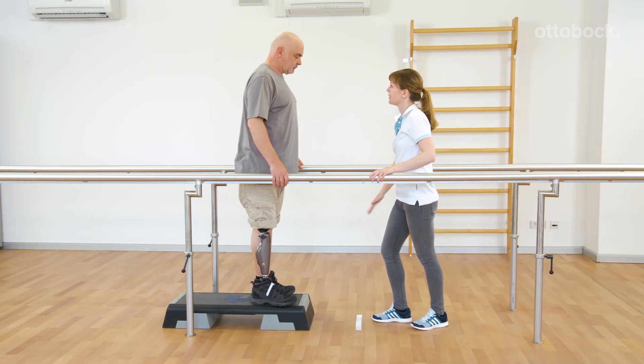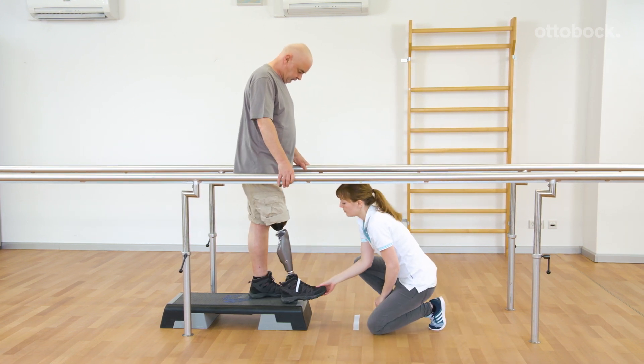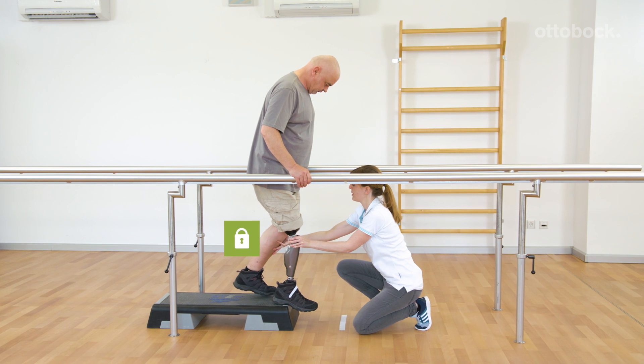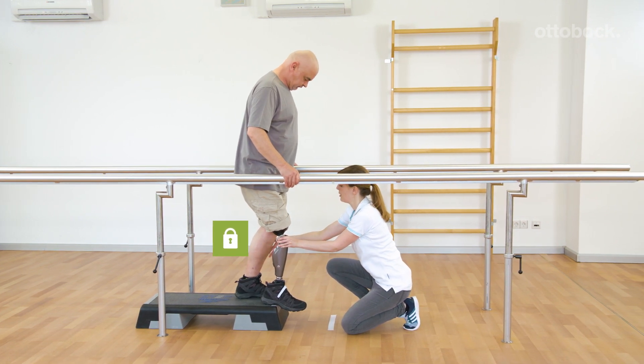Franziska explains the behavior of the knee joint if the stance function is activated and Gerhard wants to go down a step. Gerhard activates the stance function, standing with a slightly bent and motionless knee. The joint is locked in the flexion direction.